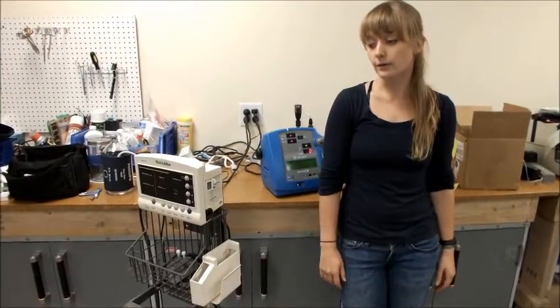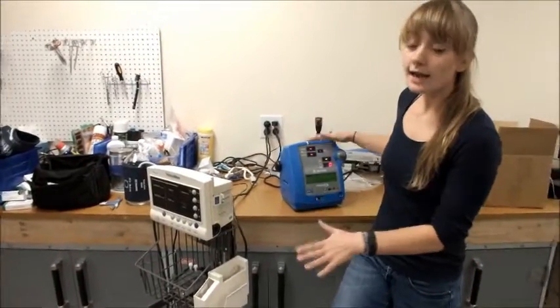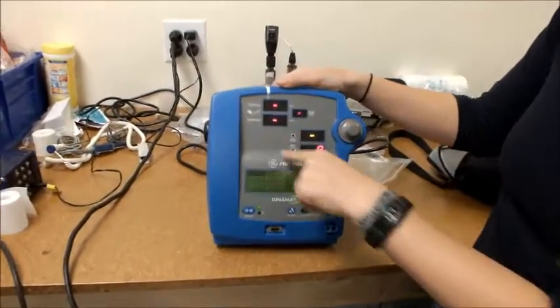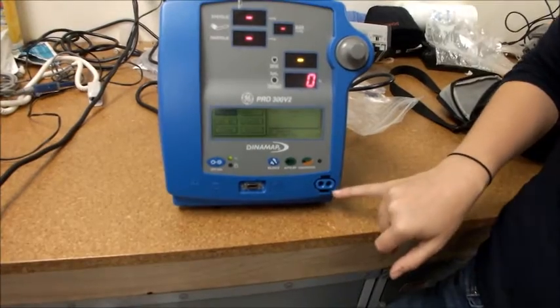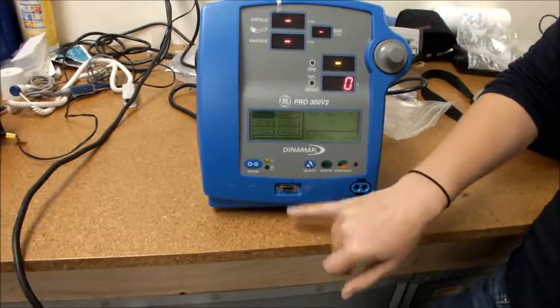The next step is to look for the kind of attachments you're going to need for different tests. Here I have two different kinds of blood pressure machines. As you can see, this one takes blood pressure and also SpO2 or oxygen. So we're going to need an attachment like this for blood pressure and an attachment for SpO2 that can connect to this.